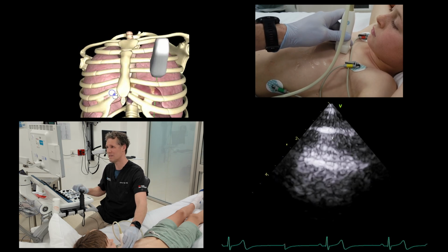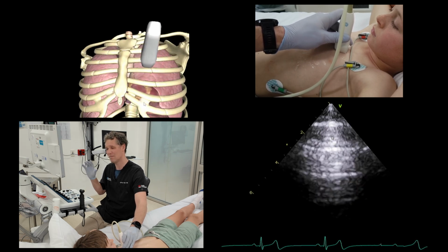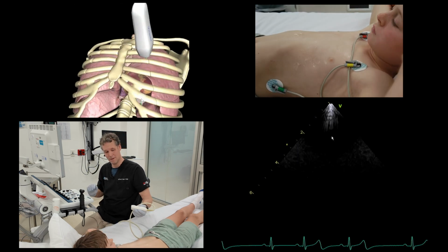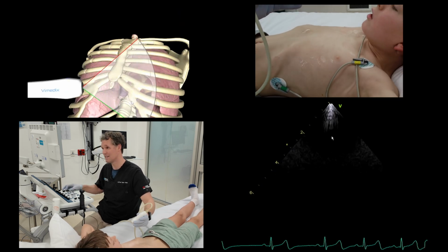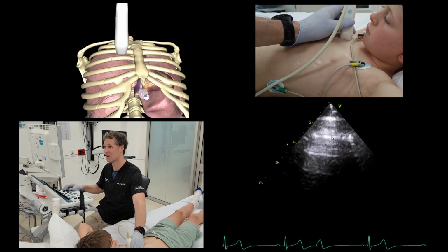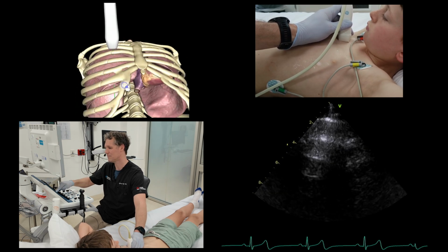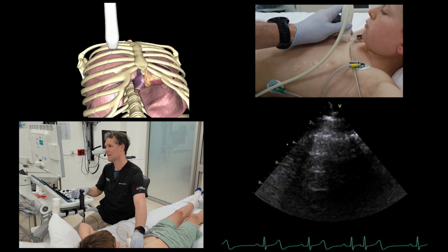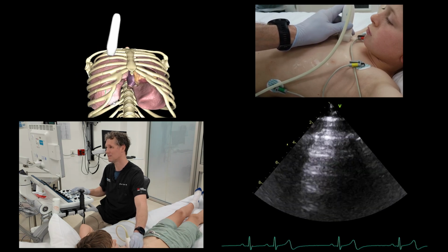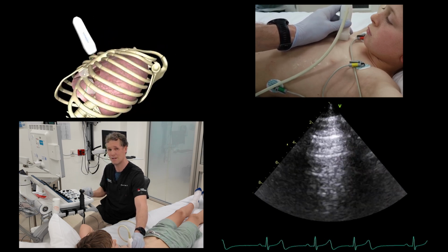One of the things I do is just little bits of fanning from one way to the other, just trying to optimize the artifact viewing. Okay. Next thing is to look for the parenchyma. So the parenchyma, we're going to need to increase up our depth to about 10 centimeters or so. And again, same places. Here's our go in the right upper zone. And I'm just going to try and optimize the TGCs. And just do little bits of fanning one way or another, just trying to maximize and snuggle into that intercostal space. So just little circular movements just to nestle into that intercostal space to maximize the views of the lung.